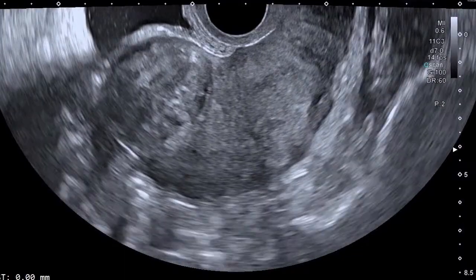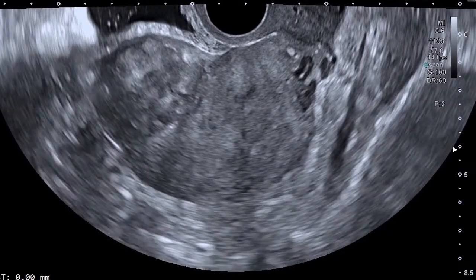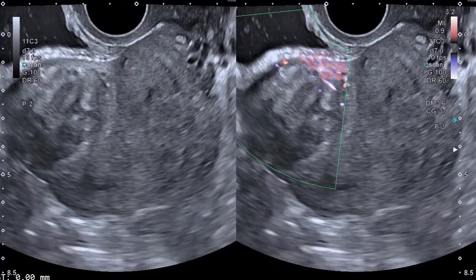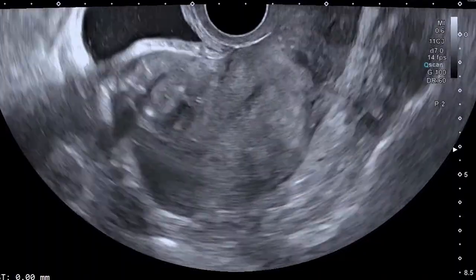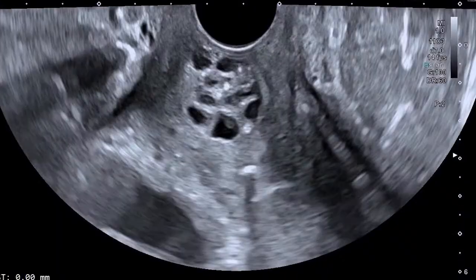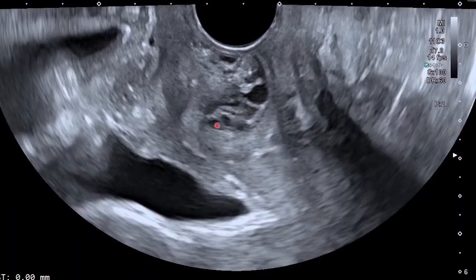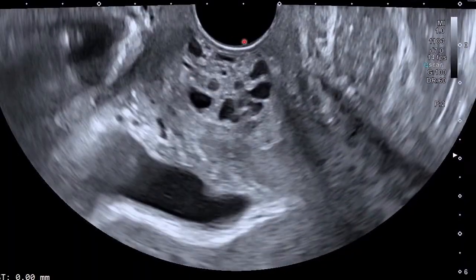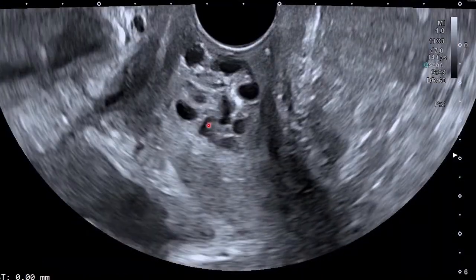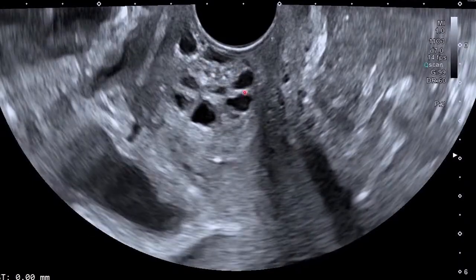The referring clinician was saying that there is a urethral mass, but it is not in the urethra on ultrasound, as you have seen. So give me your suggestions. I also need a pool of differentials. What can this be? Initially I thought it is bowel, but there's no bowel motion, as you can see. The fluid is the only thing that is moving a bit.